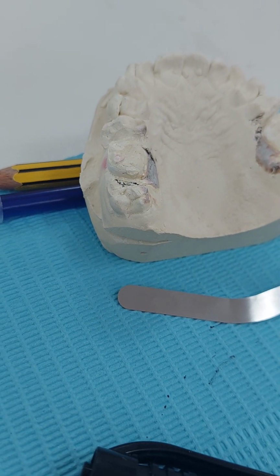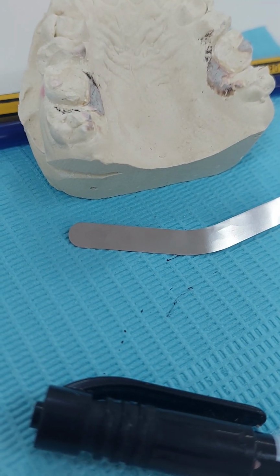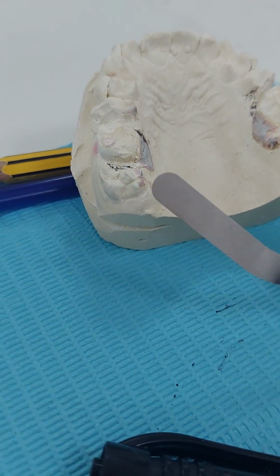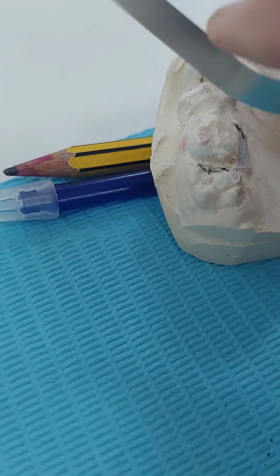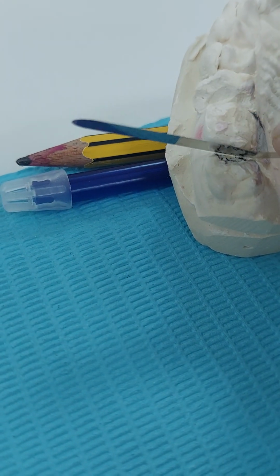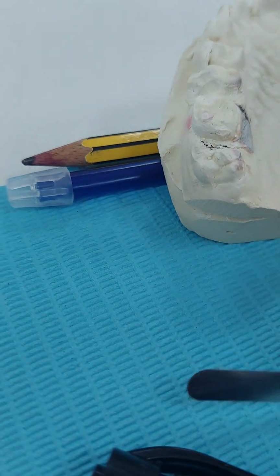Okay, this is a case where we're going to do deep marginal elevation. And this is one of the struggles you have when you have a deep margin. What will happen if you're going to place this matrix in place? Even if I place this deep part towards the gingival margin, what will happen with the matrix?